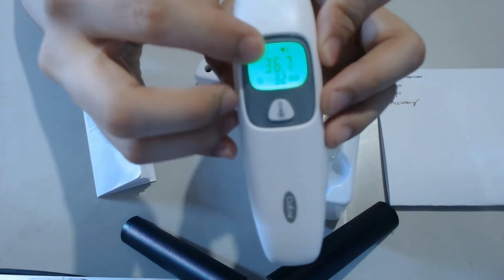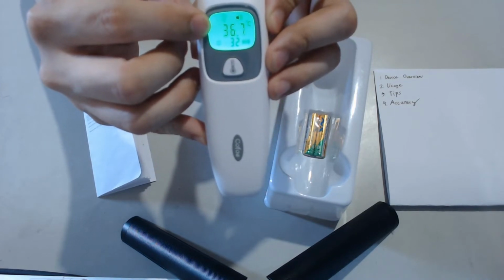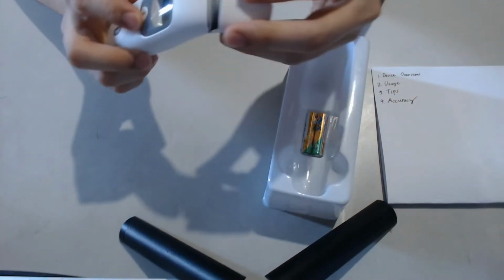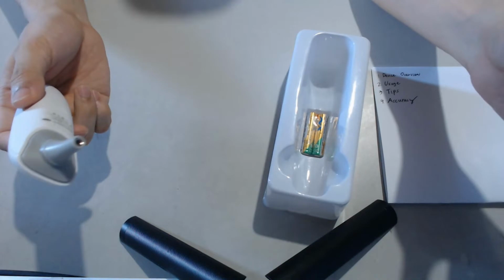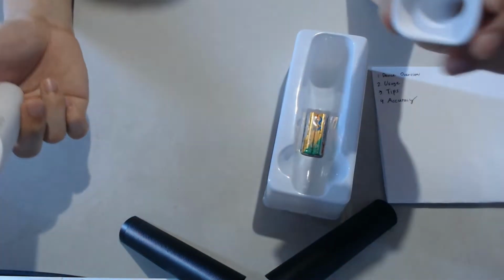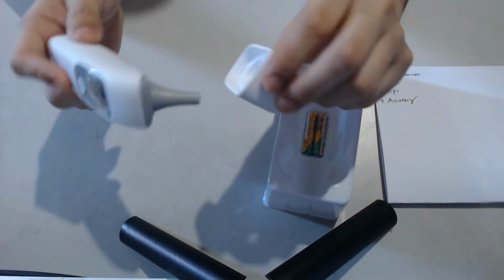Here you see, suddenly, it's not clear, but you notice that the head is missing and there's an icon that replaces it. It's actually a picture of an ear. This one can actually detect if this piece is on or not. If it's attached to the device, it's in forehead temperature mode. If you remove it, it's in ear temperature mode. So it's very important to use this as it was intended, or else you will get inaccurate measurements.